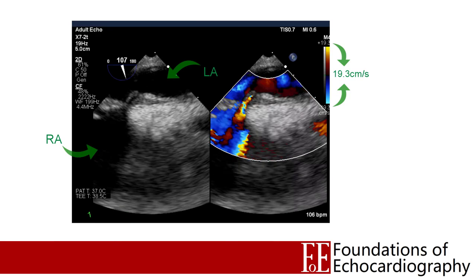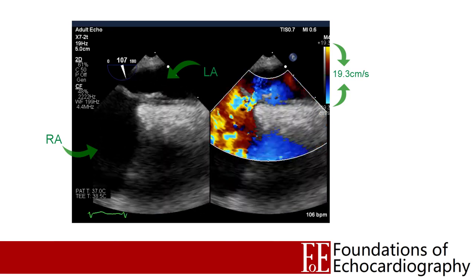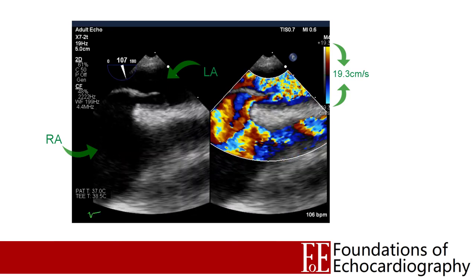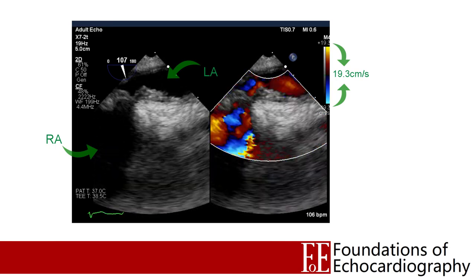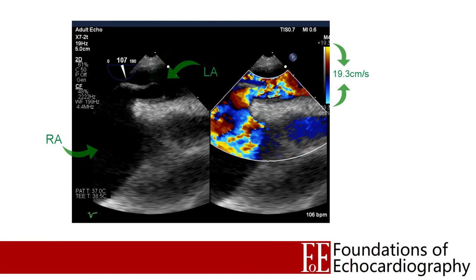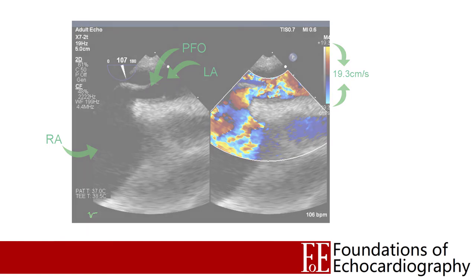In focused echo we rarely have to do this, but you should be aware that it is possible. One situation where I do this in comprehensive studies is to look for flow between the atria. Here we have a TOE image — a bicaval TOE view — where the left atrium is in the near field and the right atrium in the far field. Flow between the atria is often relatively slow compared to flow between other chambers of the heart, and so I've turned the scale down in order to better demonstrate this PFO. If you're using colour just for focused echocardiography you probably won't need to do this very often, but you should be aware that your machine will allow you to do it.